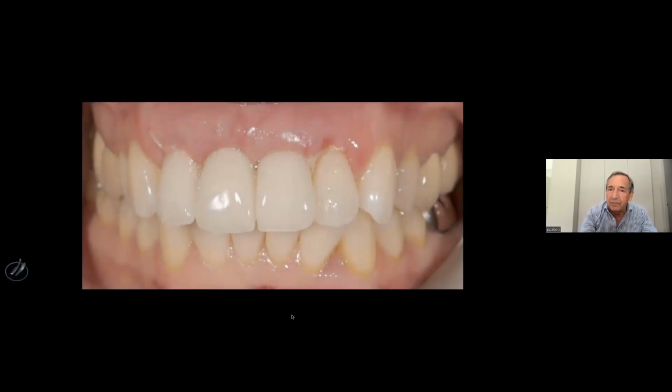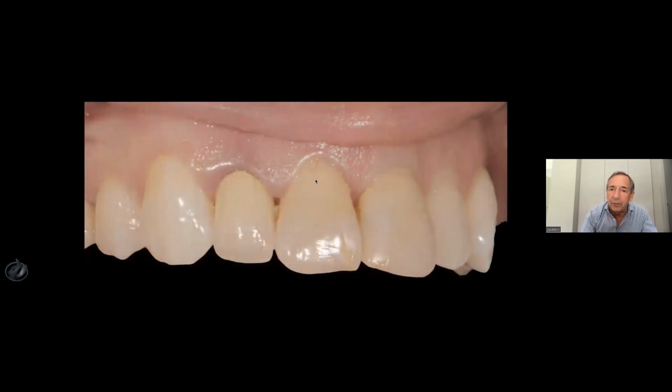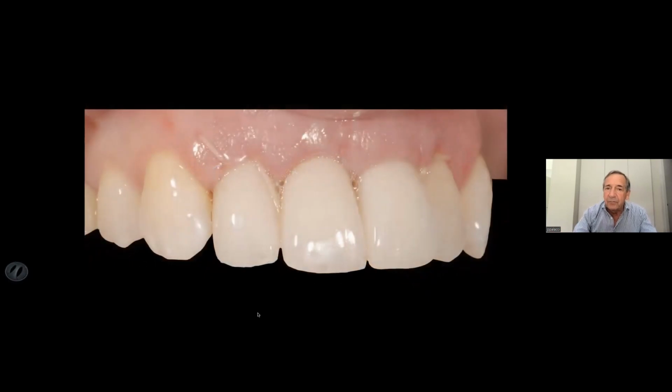And this is the following day. Beautiful tissue. Time goes, we went from there. Look, you see, you remember the tissue was bluish, thin, inflamed, and suddenly, with immediate loading, after a few days, everything's changed definitely, tremendously.